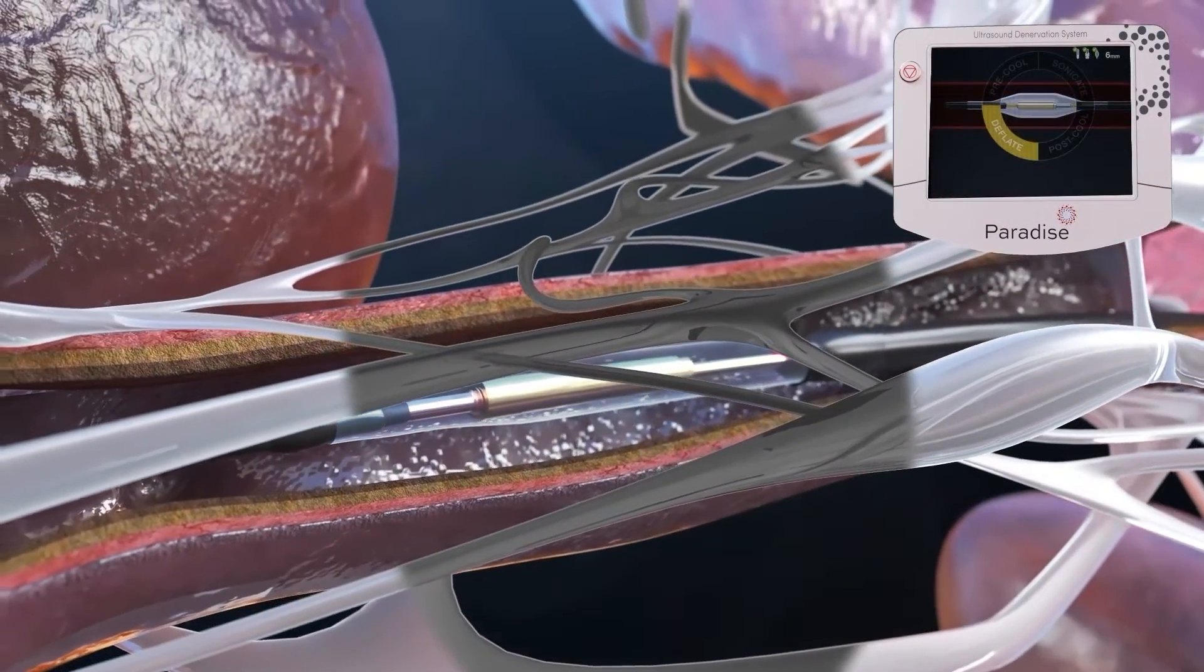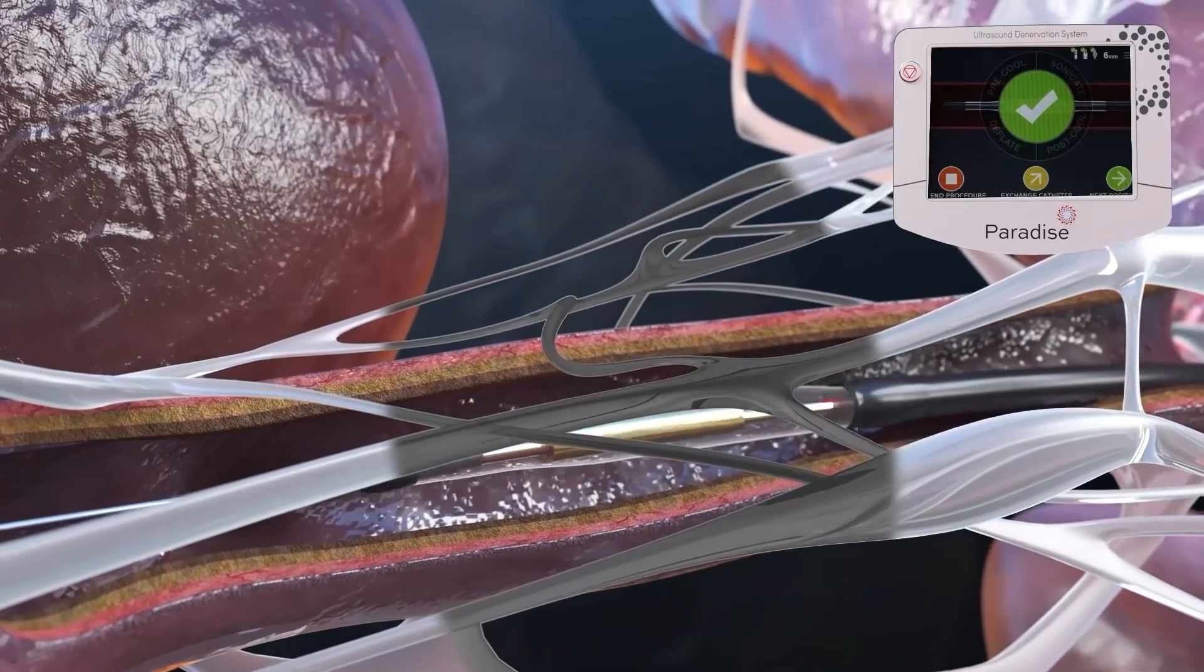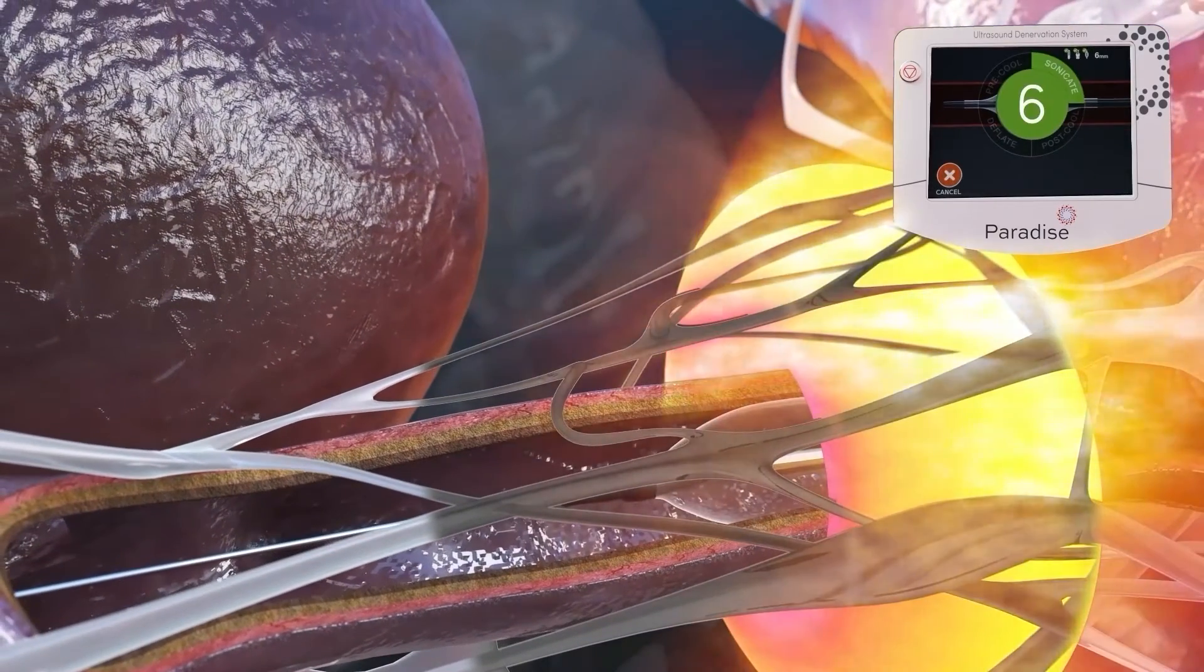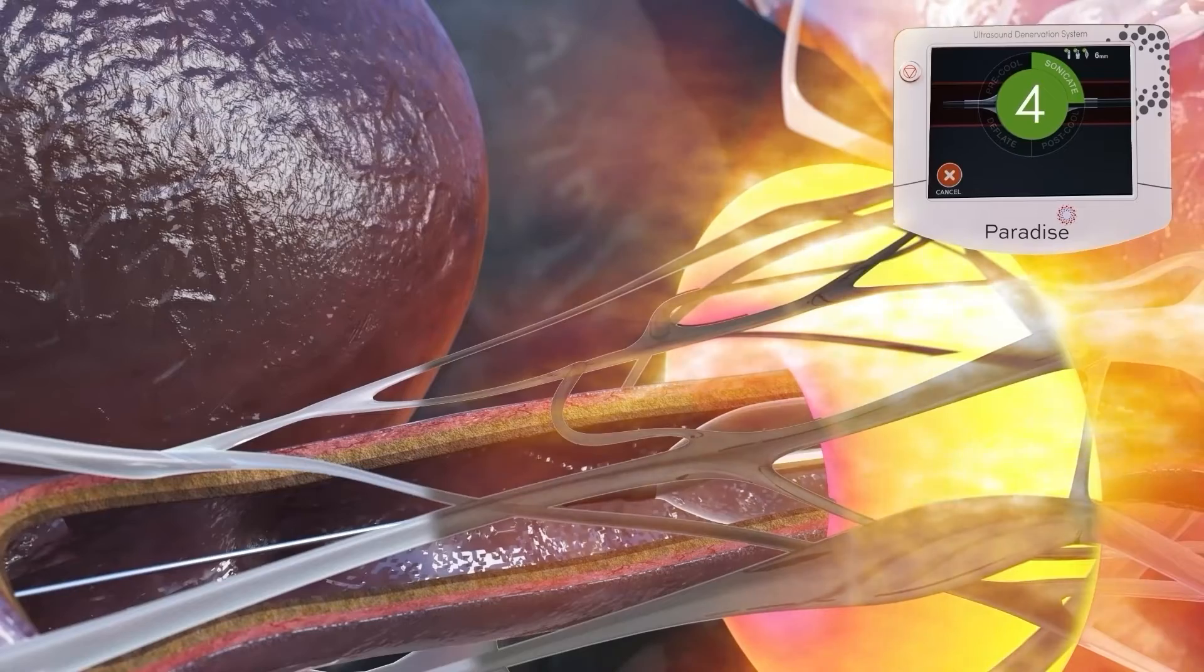After a brief post cooling step, the balloon is automatically deflated. The Paradise catheter can then be moved to additional positions within the artery.